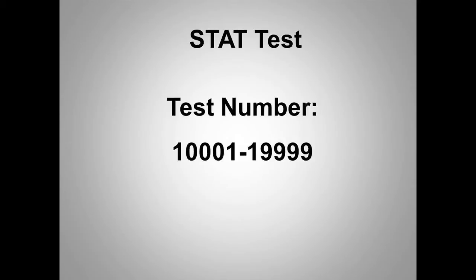If the QC test has failed, the analyzer will automatically switch to STAT test mode and cannot be changed. QC test mode is used to test positive and negative controls. QC test numbers range from 200001 to 299999 and reset to 200001 every day automatically if auto-reset is set to yes.